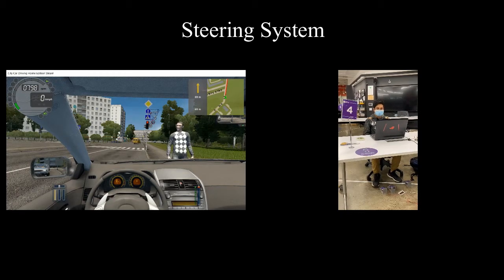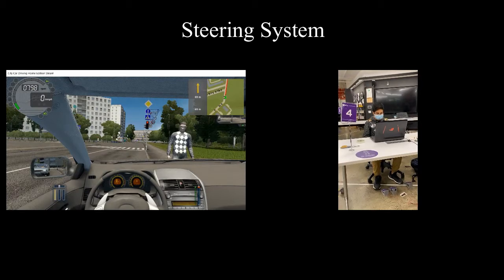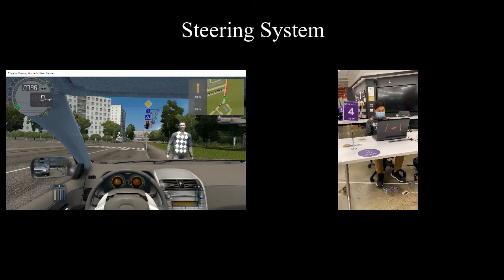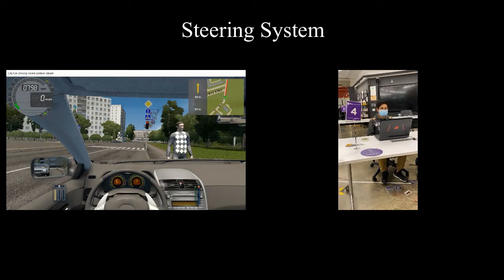Now amputee Jose will demonstrate the driving system. Press shift, which will calibrate the accelerometers. Press brake, press gas.